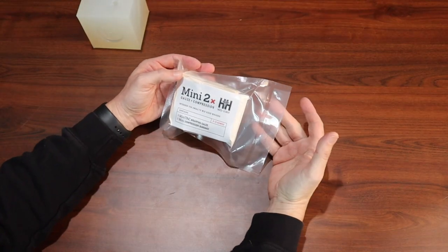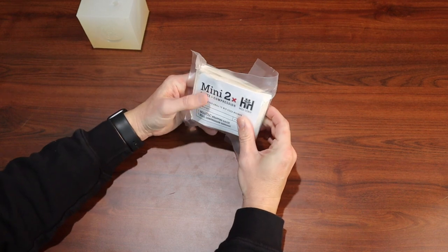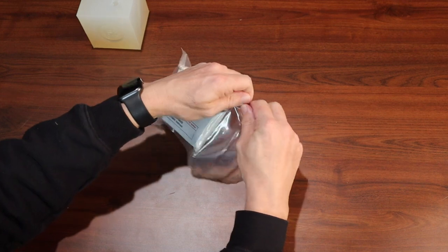Let's open up the Mini 2X and take a look at it. So we're going to have some compressed gauze — it's their Mini-Tac gauze, non-hemostatic agent. And then we have a pressure bandage, which is a fancy H-wrap. So let's take a look at the packaging. It's vacuum sealed, nice and compact. We have some tear points that we can tear open.